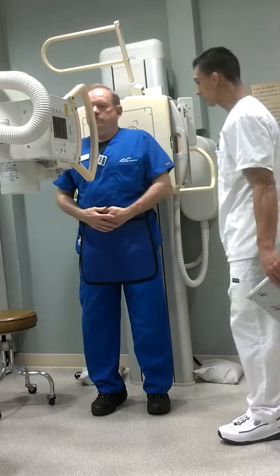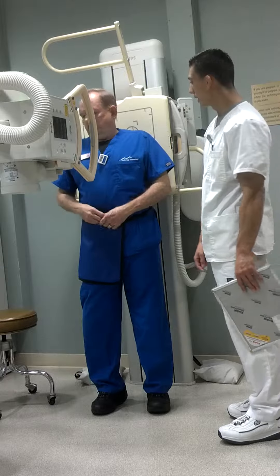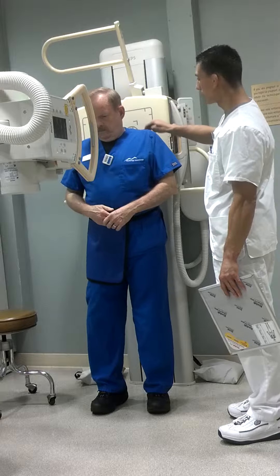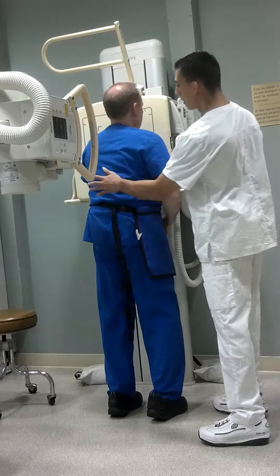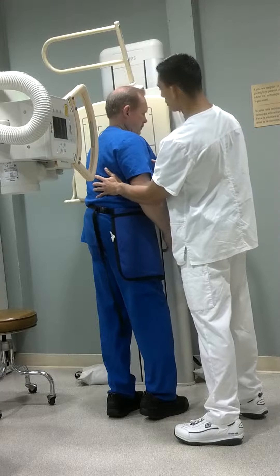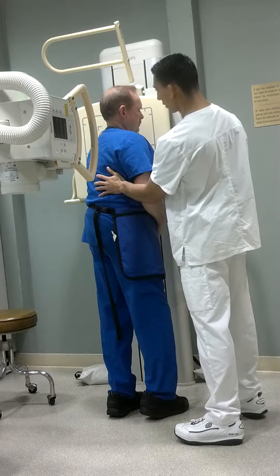Our last shot here is the shoulder wide view, and I'm going to have him turn around and face the Bucky. We'll have him face the Bucky and I'm going to rotate him about 45 to 60 degrees to the LAO side there, and that looks about 45 or so.